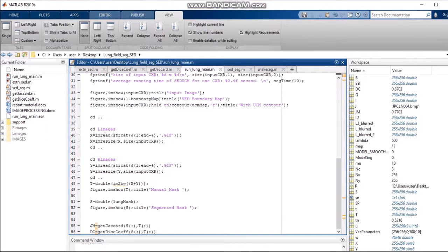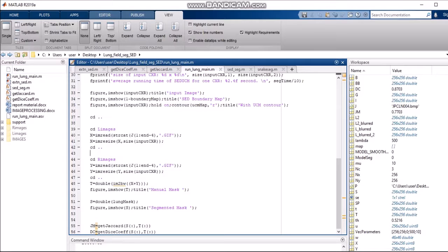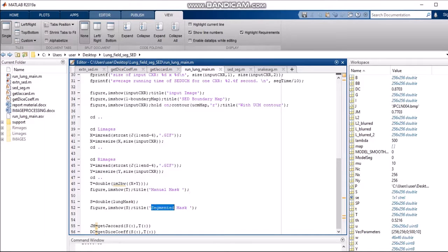We change the directory to the left images and right images, resize them so that our input image and left or right images will be the same size, and combine them together for further analysis. Then we do the manual masking — im2bw changes the image to black and white so the manual mask is shown. After that, we perform the lung segmented mask and call the Jaccard index and Dice coefficient methods in the main function.